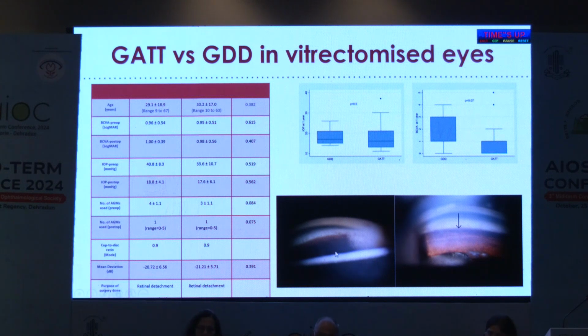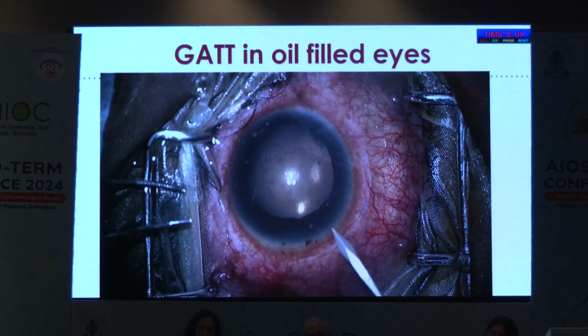Again, these are the emulsified oil bubbles pre-operatively. Post-operatively, we can see the incision, and the oil bubbles are no longer there. So two factors lead to disappearance of oil. Of course, one is that we are doing surgery and we are irrigating the anterior chamber and aspirating the oil bubbles. But also they may be outflowing through the new tract and the Schlemm's canal that we have just created. So this was one case.